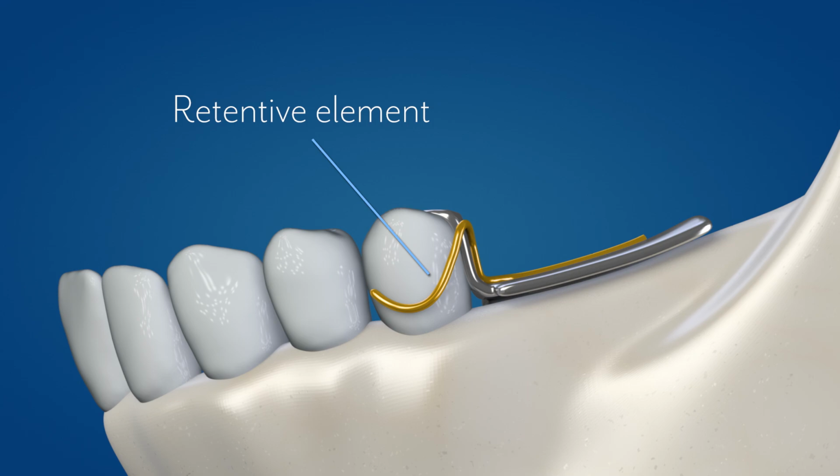Since traditional embodiments of the retentive arm were created using a drawn platinum gold palladium wire, commonly termed wrought wire, the composition and internal structure of this wire conferred some decidedly advantageous behaviors to the retentive arm and to the clasp assembly.